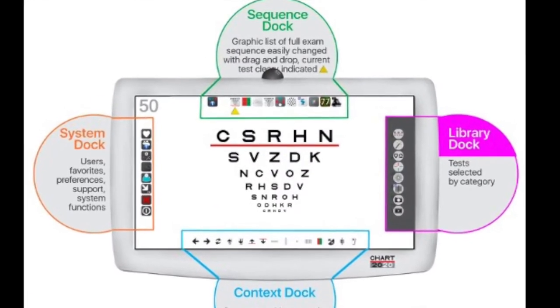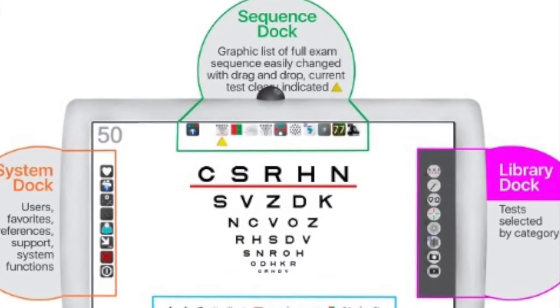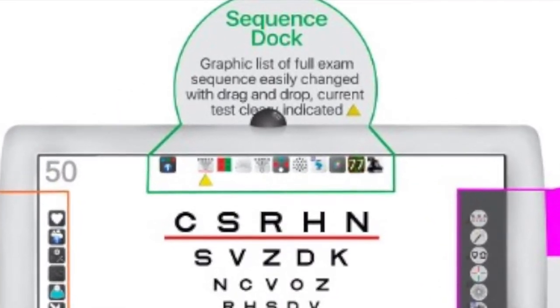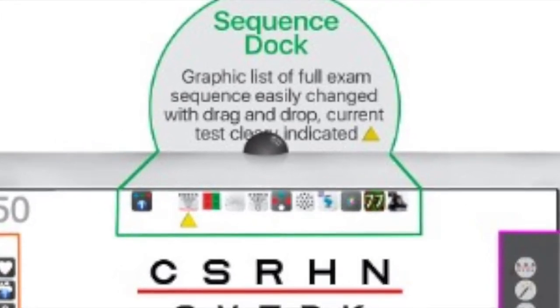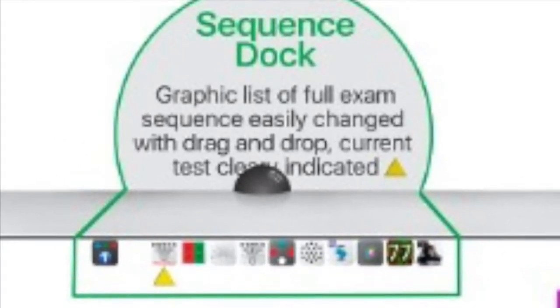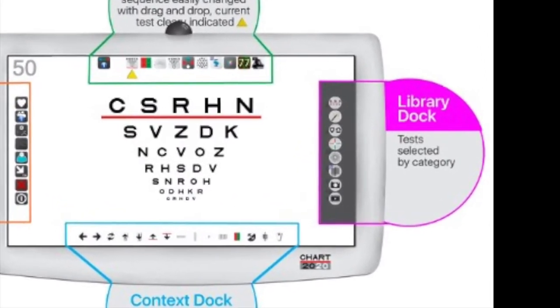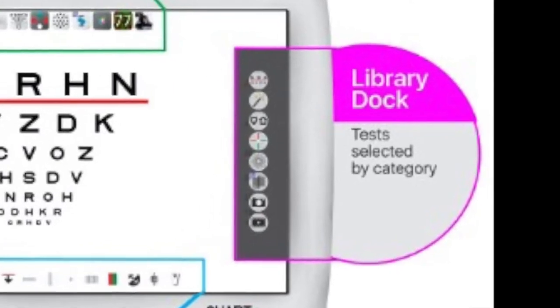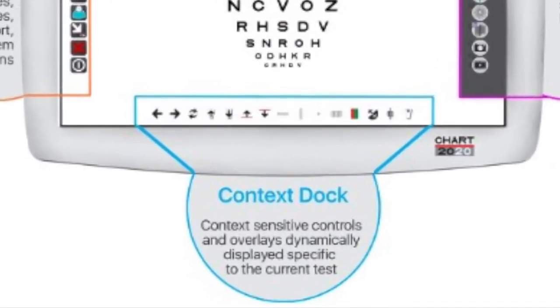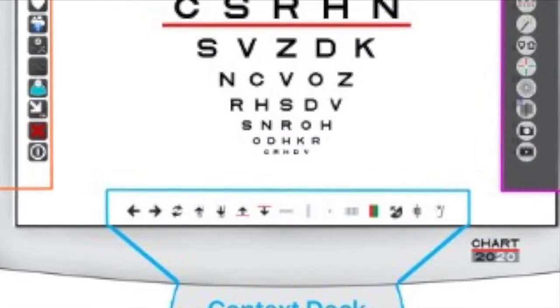The four Chart 2020 docks. Chart 2020 is an advanced icon-driven application that allows significant depth in testing strategies with a paradigm that is both simple and flexible. The heart of the control system is four docks that are dynamically exposed and hidden on each screen edge: Sequence Top, Library Right, Context Controls Bottom, and System Left.